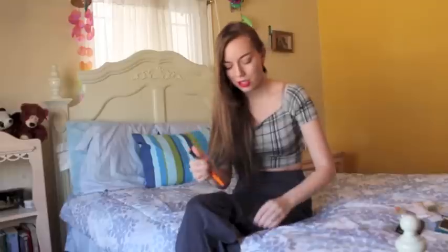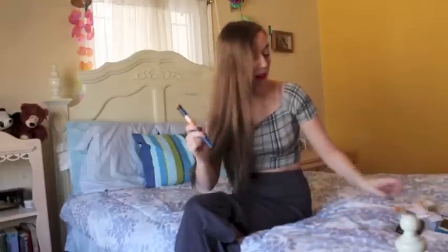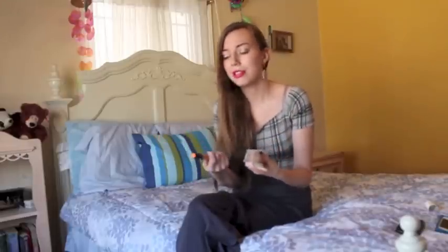And then I moved on to the insulin pen, which looks like this. Just gonna give you guys a quick example. You basically attach the needle part to this and you tell it how much insulin you want and you inject it like that. So I went through both of these different methods before I decided I wanted the pump, and these are great ways to do it. These are perfectly fine. I just prefer the pump and I think it is so much easier.